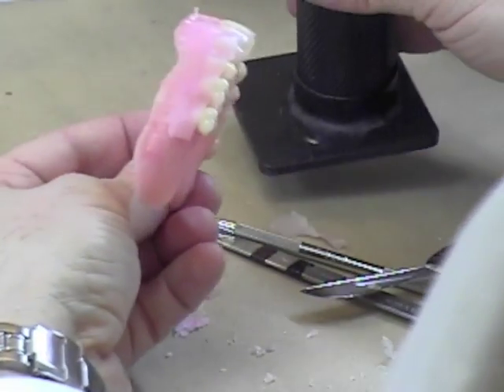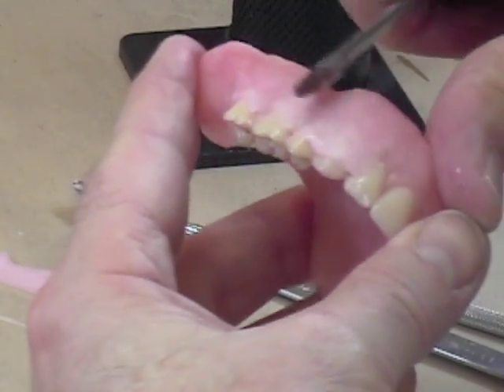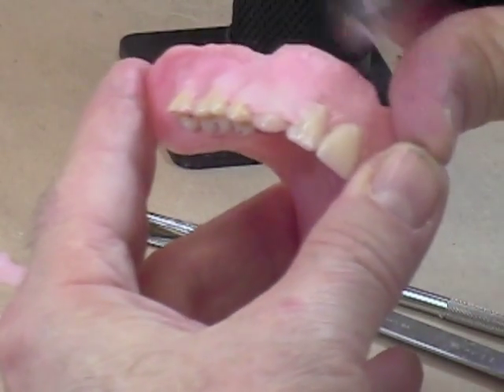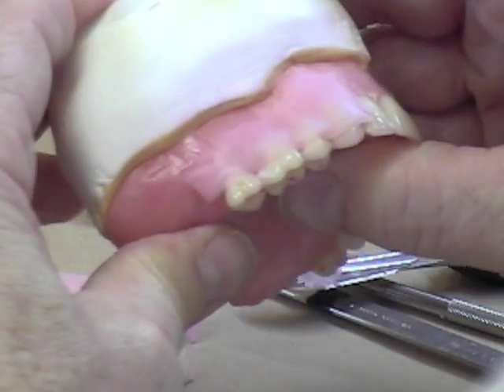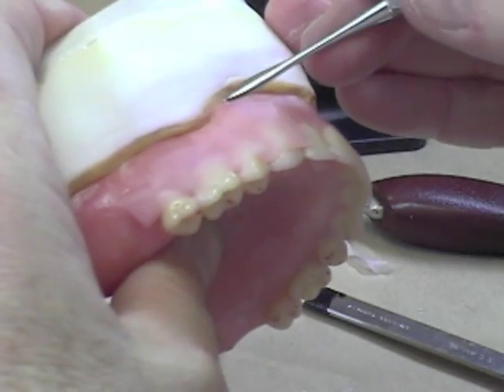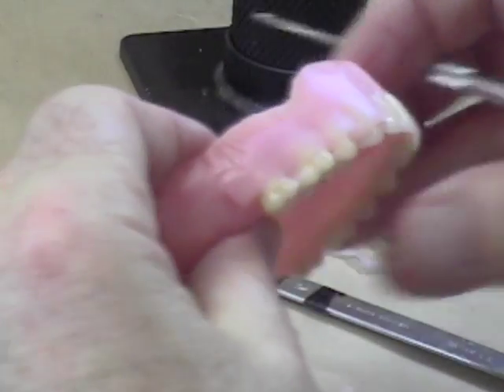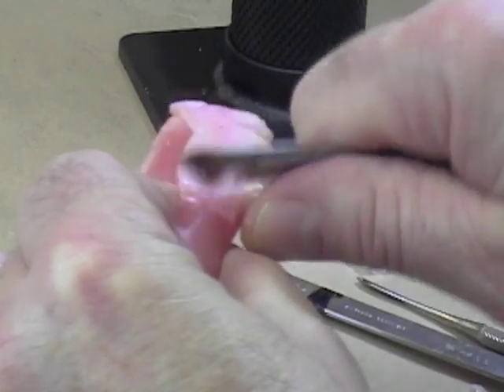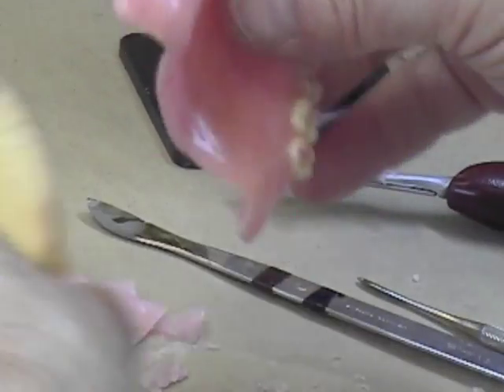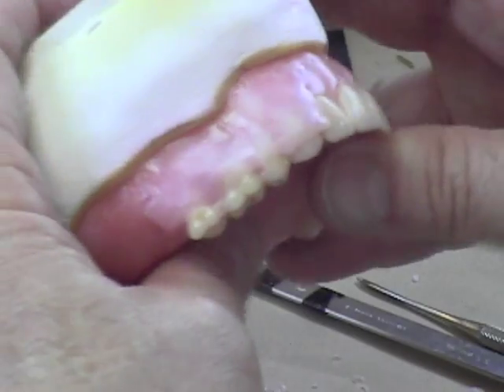Get that wax on close to where you want, soften it again, and make sure it's not too thick. Apply the flange of the denture and, while it's still soft, push it as firmly as you can to make sure it fits on the denture cast. You can see there's a little bit of excess pushing up past the land area — trim that back. Because you've spent a lot of time on your occlusion, you don't want that preventing the denture from seating back down on the cast.